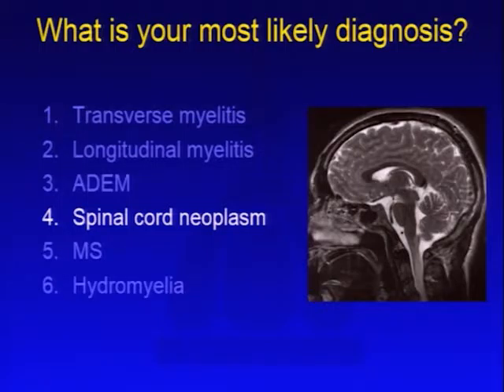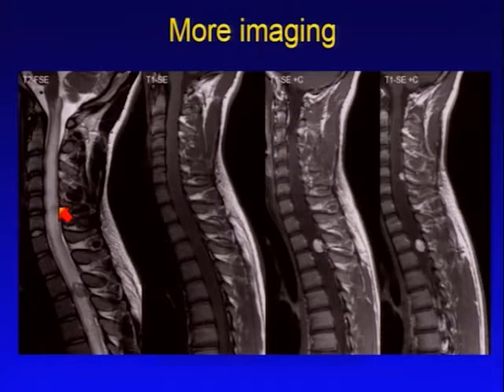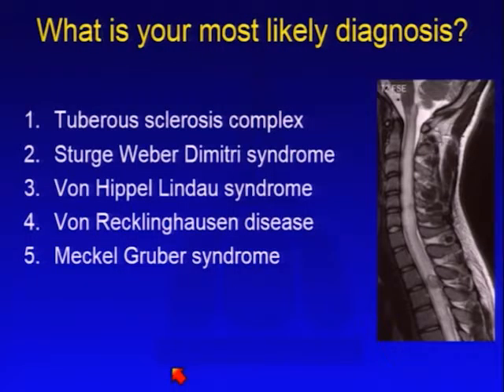So we called the patient into our hospital, we did imaging, and what do we see? We see multiple, strongly contrast-enhancing nodules with a lot of edema, vasogenic edema, maybe also some venous edema, and you see a lot of small vessels next to it. You see those vessels? Over here and over there. So what is your most likely diagnosis now?